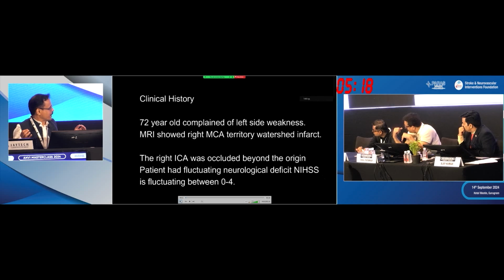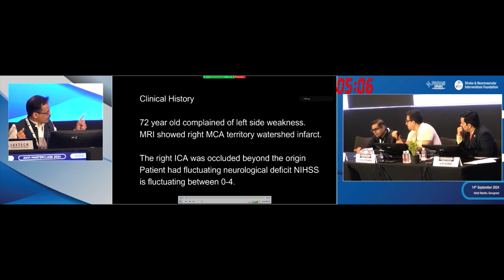So we just decided to go ahead with it anyway, in Indian circumstances. So it was in my mind, if I come to stenting, I'm in trouble. There is no money. Thrombectomy, I can manage. So we checked the ACOM beforehand. I knew there was a great ACOM. So we had checked it beforehand.